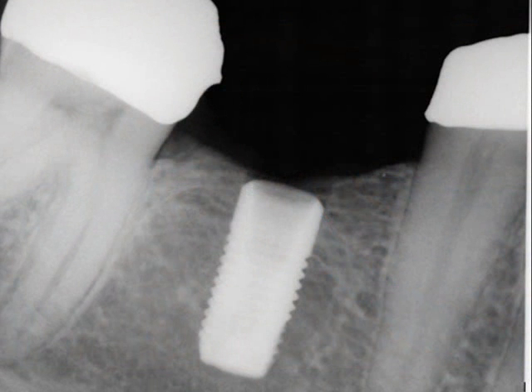So it's a great revolutionary technique in dentistry to have this much accuracy and precision in placing the implant exactly where we had planned it and designed it to go.